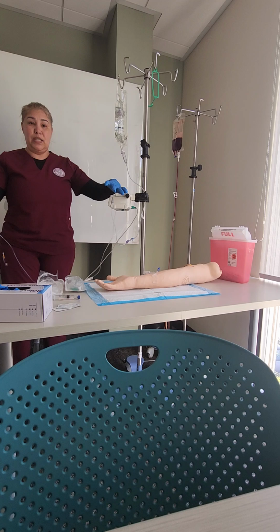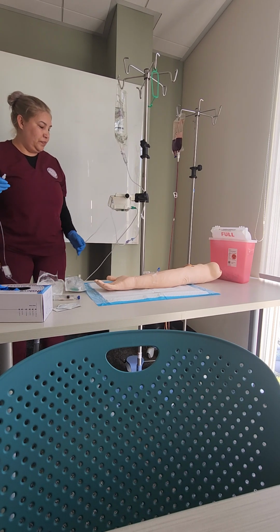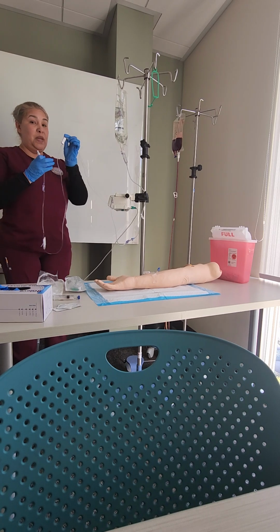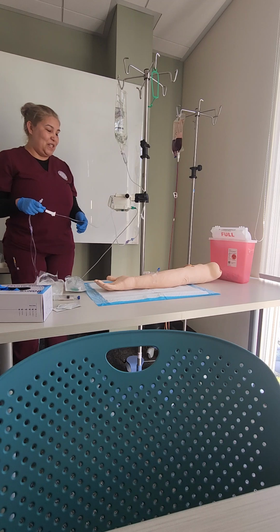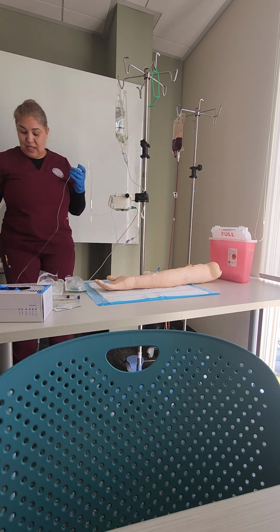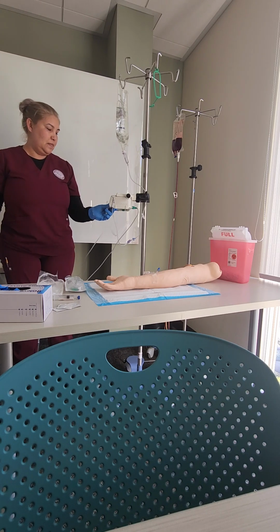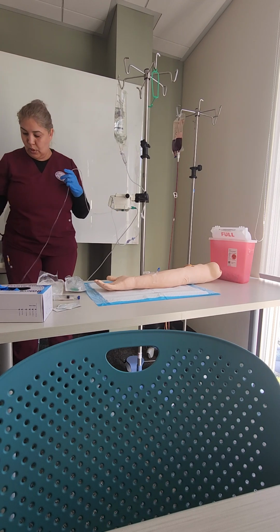It's asking me to make sure it's not connected to my patient. No, it's not. I'm going to hit OK. And now it is asking me for an occlusion. Why? Because my clamp is on, so I have already unclamped it. Confirm, say OK. And now it's going to prime it. Okay, it's priming.